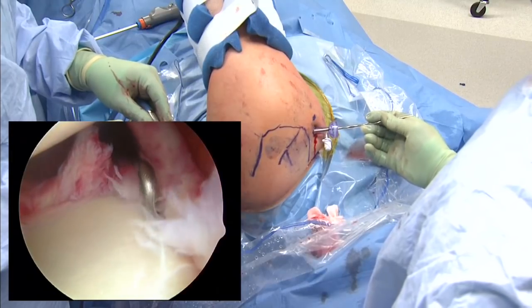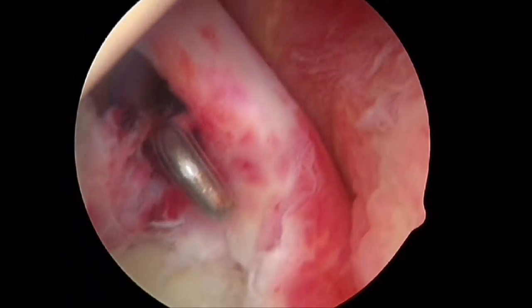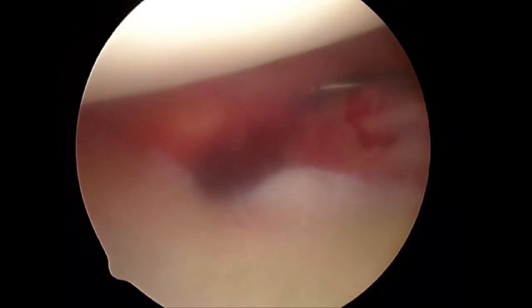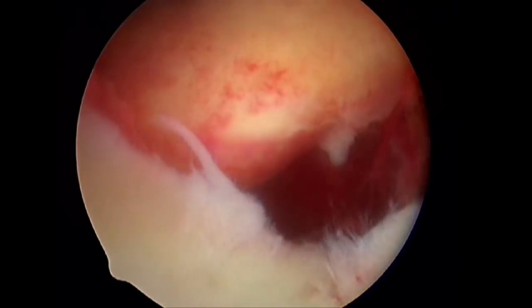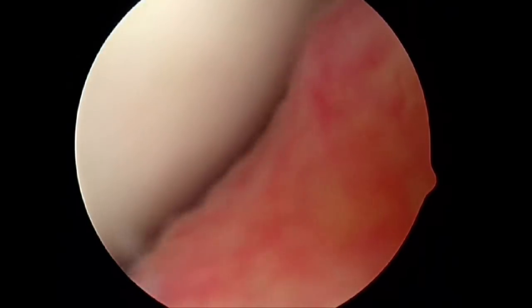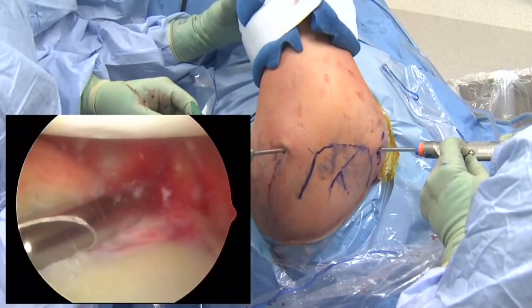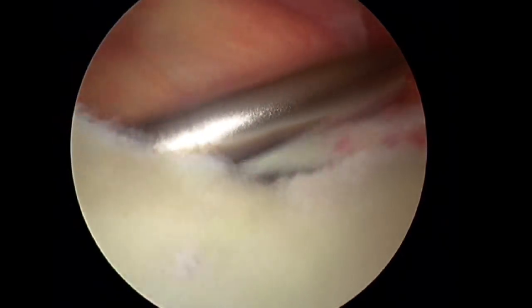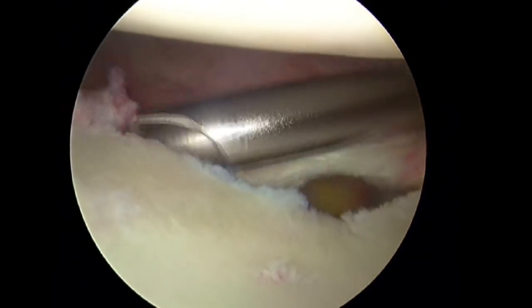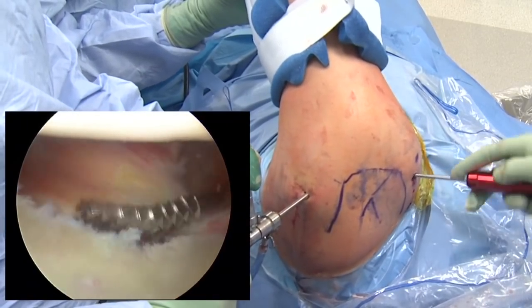The next key is to identify the pathology. This patient has a SLAP lesion as well as a large Bankart lesion. The fact that it's a large Bankart lesion means we're going to do a fair amount of Bankart repair with some capsular repair. We look at the undersurface to determine there's a mild Hill-Sachs impression, nothing of significance. We then decompress the anterior glenoid rim with our shaver and different instruments to decorticate the bone, and do the same with the SLAP lesion above because we're subsequently going to repair that.